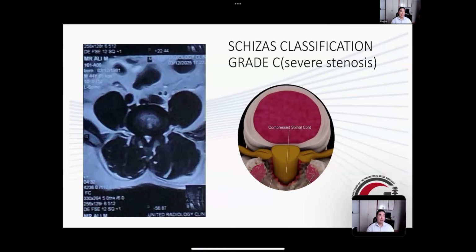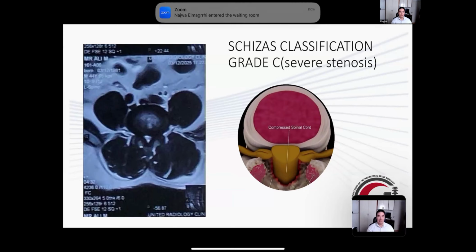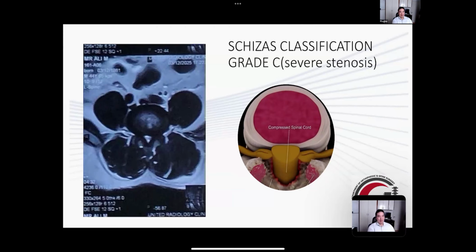So when doing the surgery, it's important to understand how we do it, because it has consequences. If you are too aggressive, maybe to the disc or to the facet, you can also lead to instability. That's one thing I would like to add, and also compliment, because I like this way of thinking, that we're preserving the anatomy more to the natural.